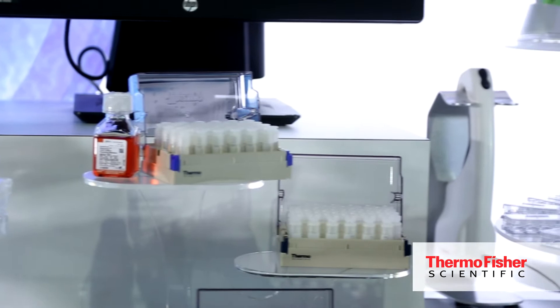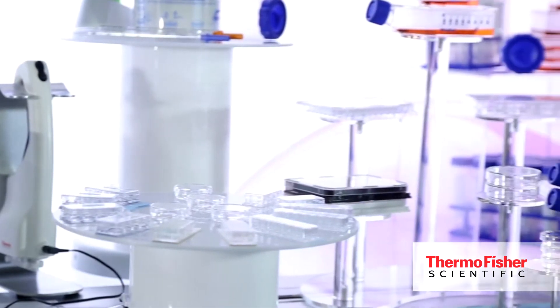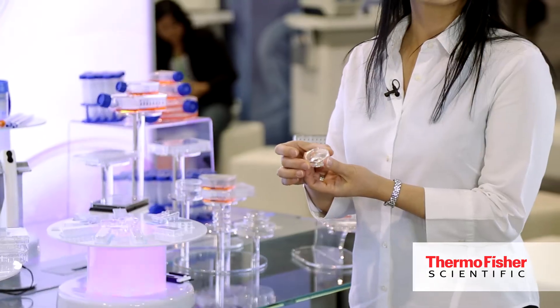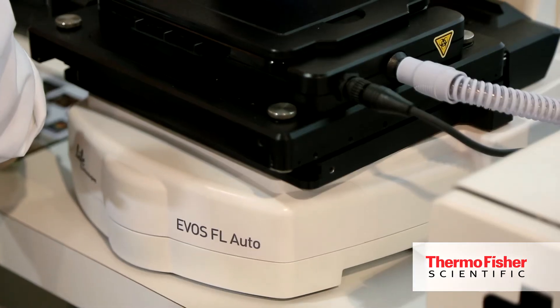Here we have the famous Lab-Tek chamber slides as well as the imaging dishes that have a coverslip bottom to facilitate immunocytochemistry, and they work perfectly well with the EVOS microscope system.